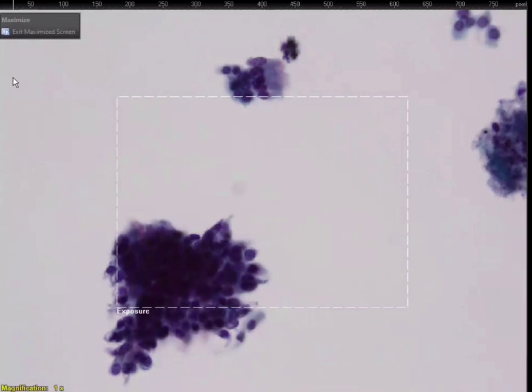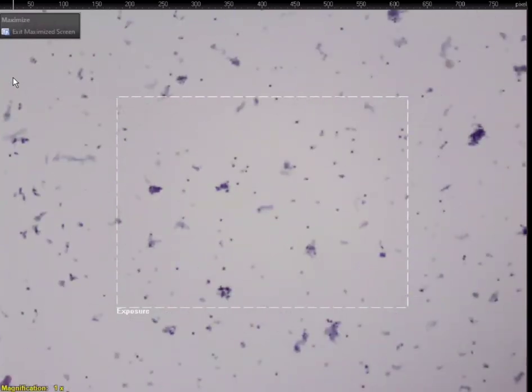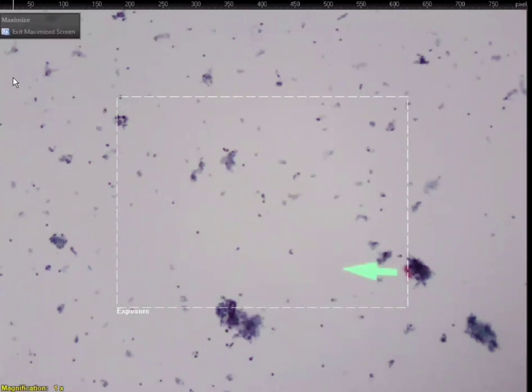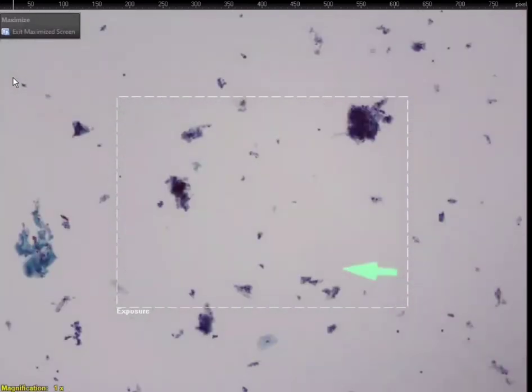This sample satisfactory? Exactly. I'm wondering, is it satisfactory because we have so much contamination? Yeah. Yes. No malignant cells, so nothing atypical. We could say, you know what, this is suboptimal, or we're questioning if this is even satisfactory. If they're telling us it's a lymph node, but where's all the lymphoid? It's very scant. There is some. I mean, there's lymphocytes all over in the background, but you know, for a lymph node, you want lots. Yes, right? Okay. Let me see if there's any marks anywhere.